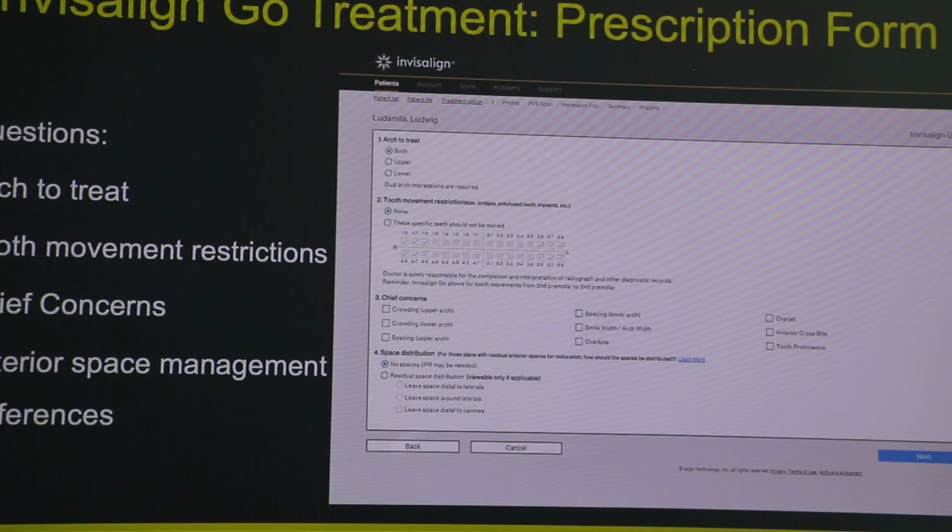Or just section the pontic and leave the section over it. I usually section the distal of the pontic, so you give yourself half a millimeter or a millimeter between the two. Just section it, and the aligners will keep fitting over it and will move individually.